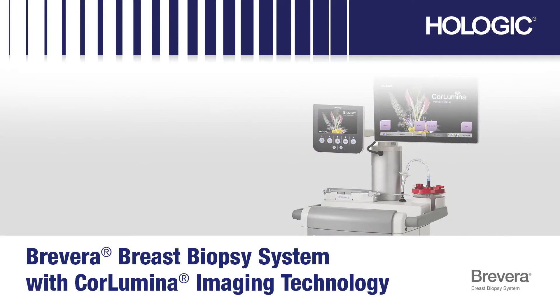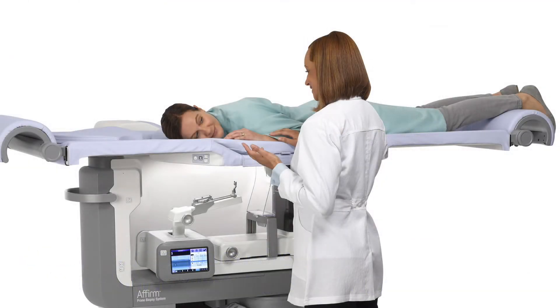Once the technologist is ready, the patient will be brought into the biopsy suite. The patient will lie prone on the table with the affected breast through the aperture hole.